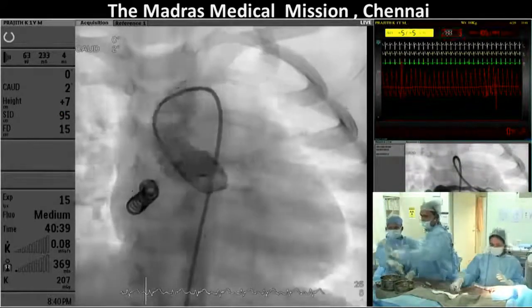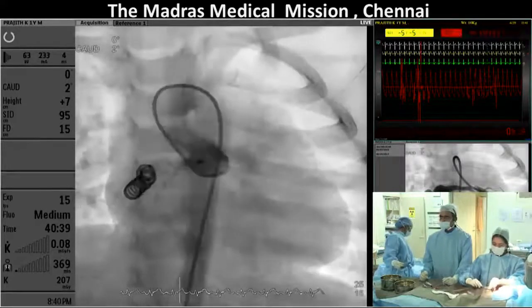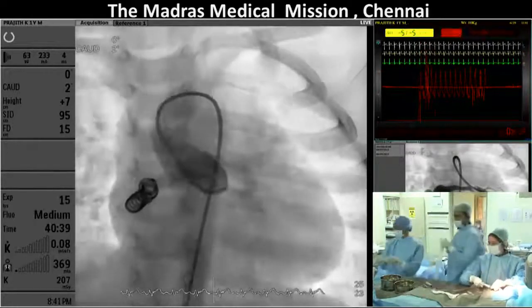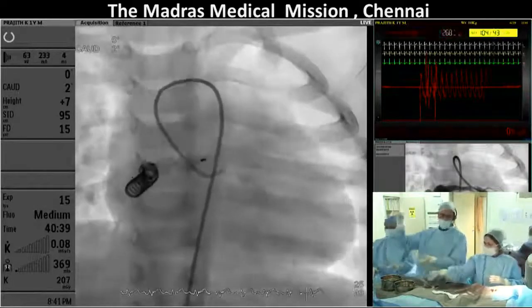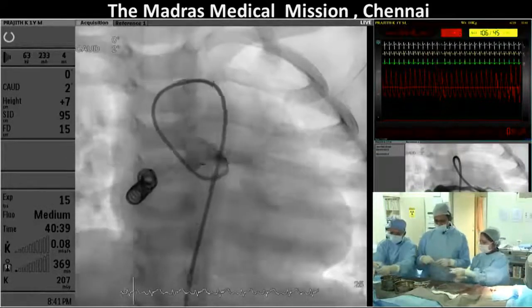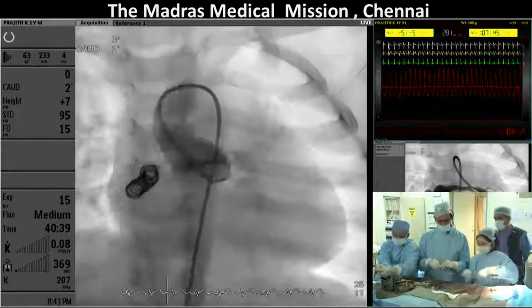I think this looks terrific. I think it's closed. Yeah, but you're filling the right coronary. I mean, obviously you want a better picture, mostly for aesthetic reasons, but perhaps not clinical reasons. It looks very good. Look at how those coils are dragging that device to the patient's right. But the nice thing is that they can't go anywhere. That's my point in using the coil tumbling technique. It actually works really very well.